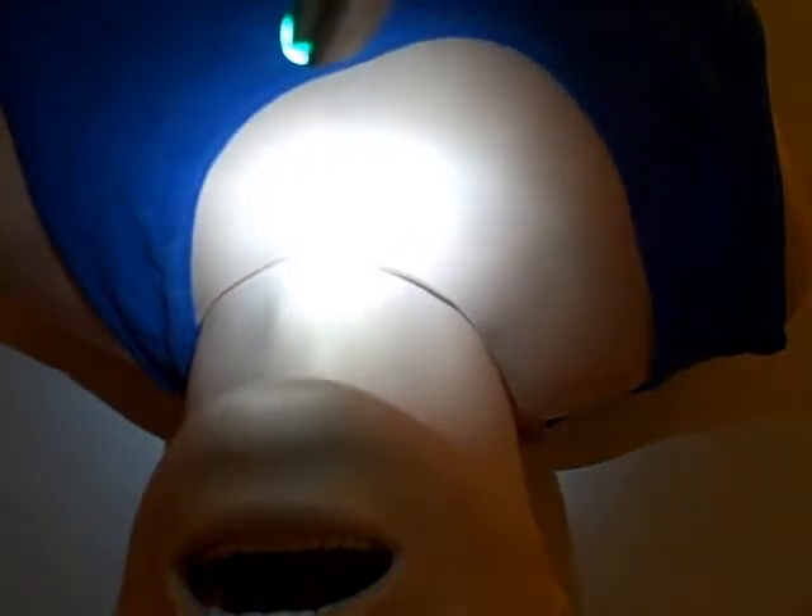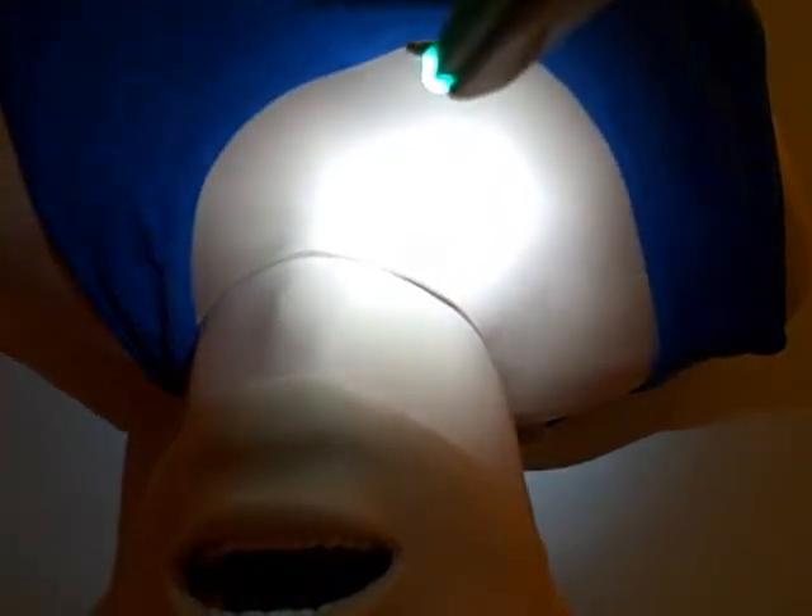Another thing you might notice is this is lighting up the chest of the mannequin. There's not any shadow at the center of the light, just like when some laryngoscopes have a bulb at the end of the blade — just like your home flashlight creates a little circle. But by using this LED, we've got a full circle of light here on the chest.